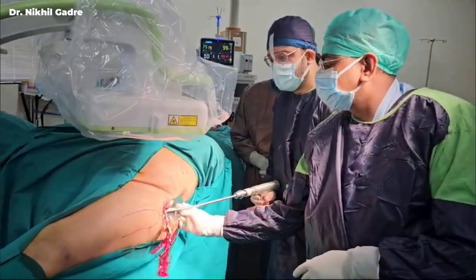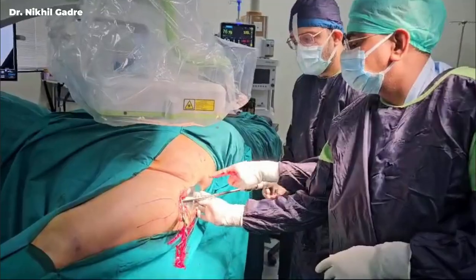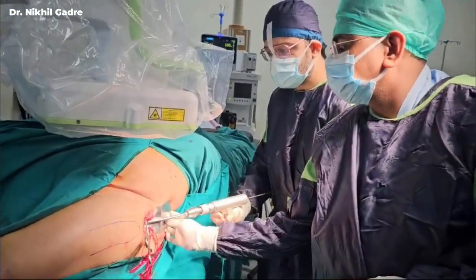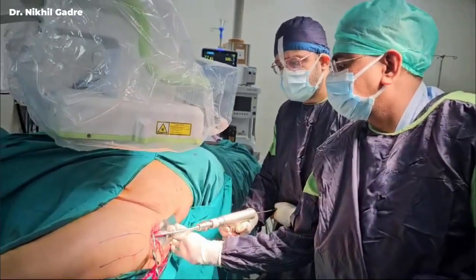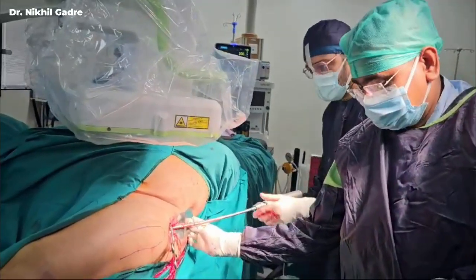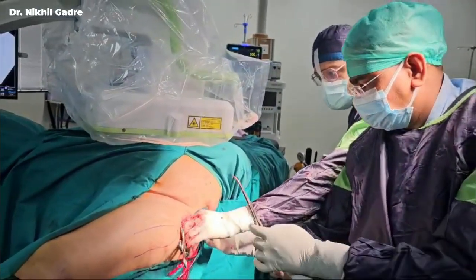You progressively ream the femur and use this protection sleeve to prevent damage to the soft tissues. You start from the lowest possible size, and when you hear the cortical chatter, you stop. Otherwise, you risk causing an iatrogenic femur fracture.